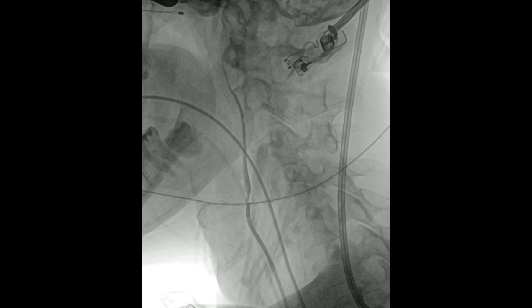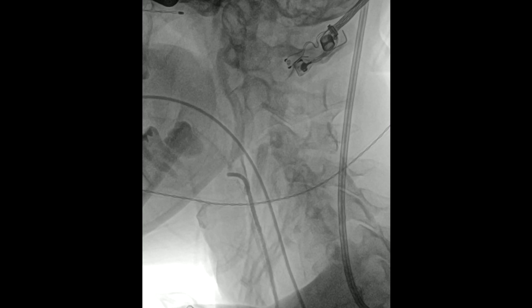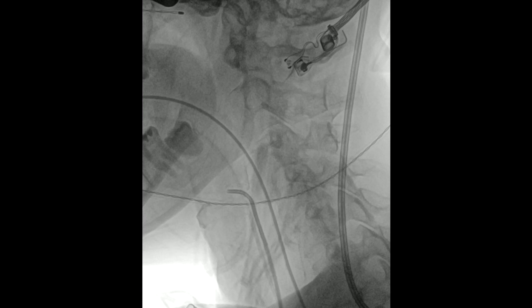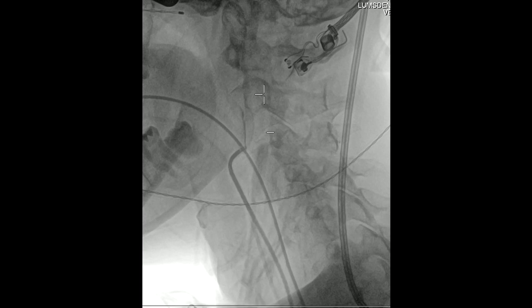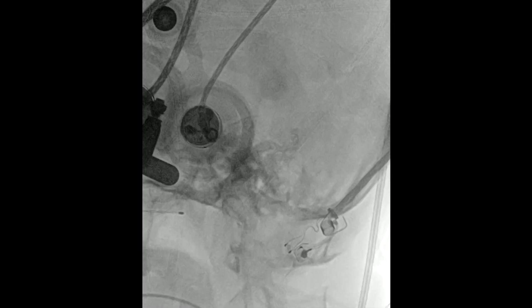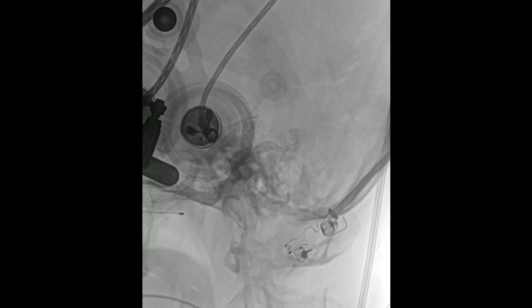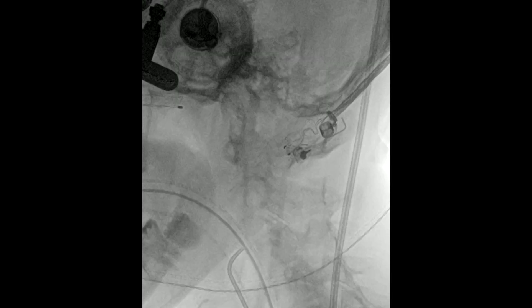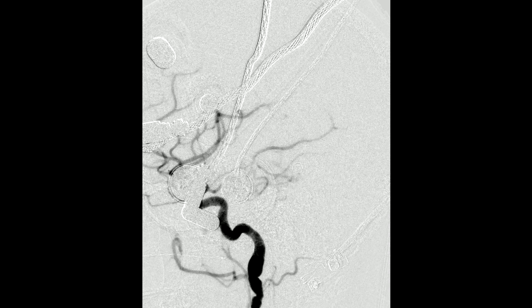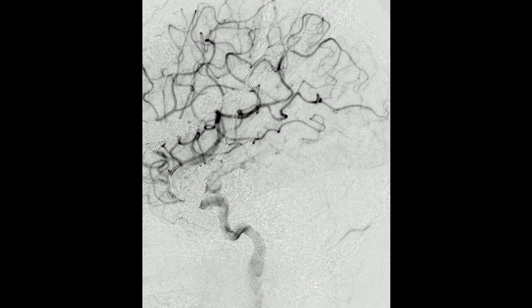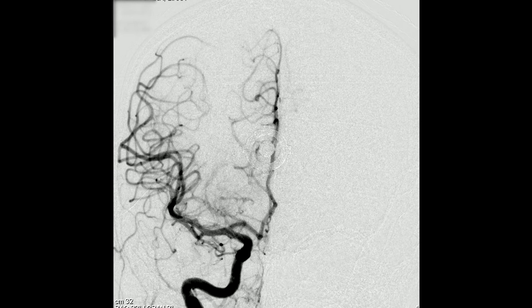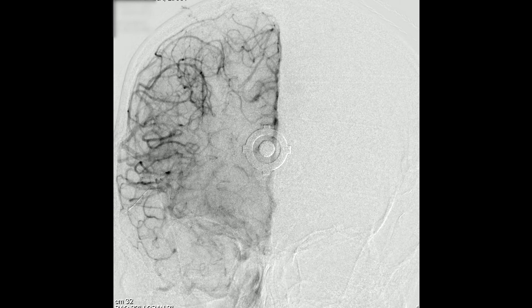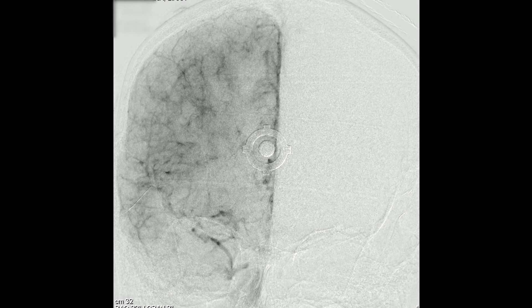This patient had some fibromuscular dysplasia. Once we've got it in position we're going to do a digital subtraction angiogram, positioning it just short of the carotid bifurcation. First we're going to do the head shots — these are the transcranial Doppler probes, which we're actually looking at. These were on because we were considering whether intervention needed to be done at the same time. Here you can see FMD in the distal carotid artery and the MCA branches filling. Then we change to the AP view and you can see the middle cerebral and anterior cerebral vessels.